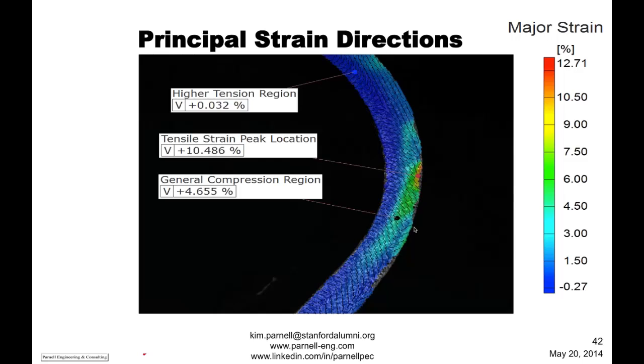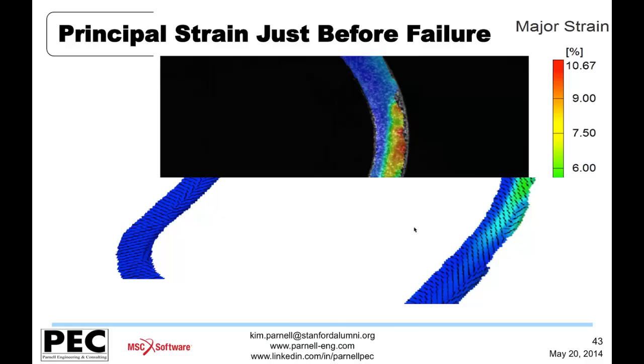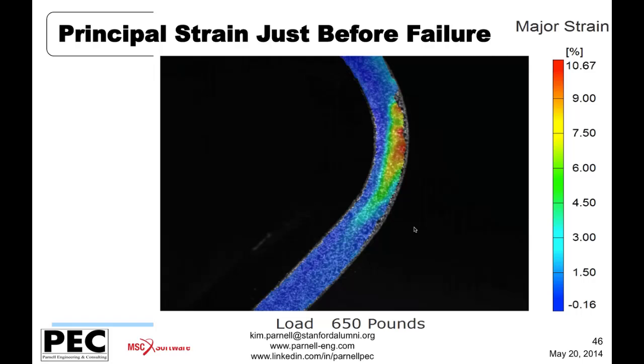Also, you can compute principal strain directions. So hard to see here, but over the fringe plot, we're also superposing the primary direction associated with the major principal strain, so the maximum principal strain value. And a little bit more close-up area here. And then finally, one just before failure. So this is looking in one of the bends of the heel component, and we're up to, for this component, a load of 650 pounds. So the way this was fixtured and loaded, failure was in the order of 650 to 700 pounds in a compressive loading mode.